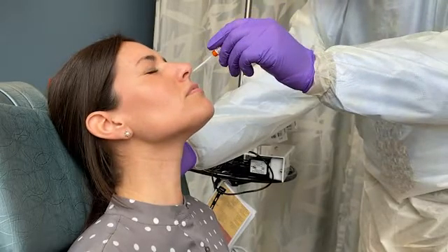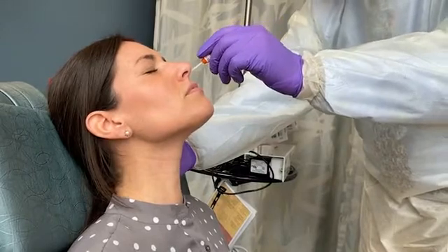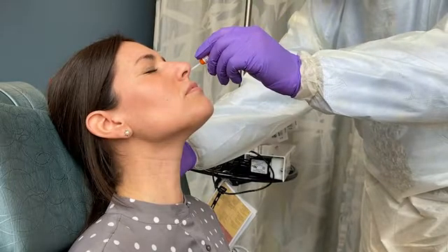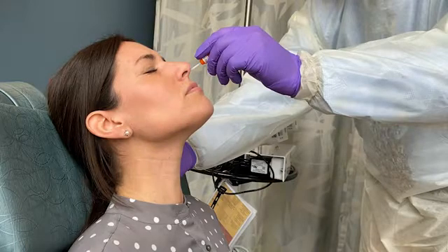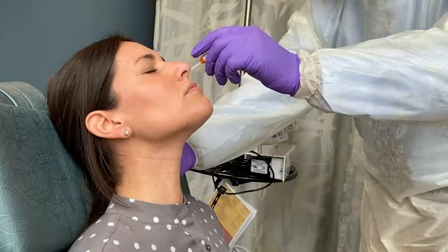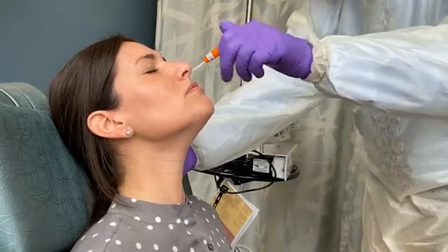If you find resistance to the passage of the swab, back off and try reinserting it at a different angle, closer to the floor of the nasal canal. Insert the swab into the nostril, parallel to the palate. The swab should reach a depth equal to the distance from the nostrils to the outer opening of the ear. The CDC recommends leaving the swab in place for several seconds to absorb secretions, and then slowly removing the swab while rotating it. Your institution may also recommend rotating the swab in place several times before removing it.